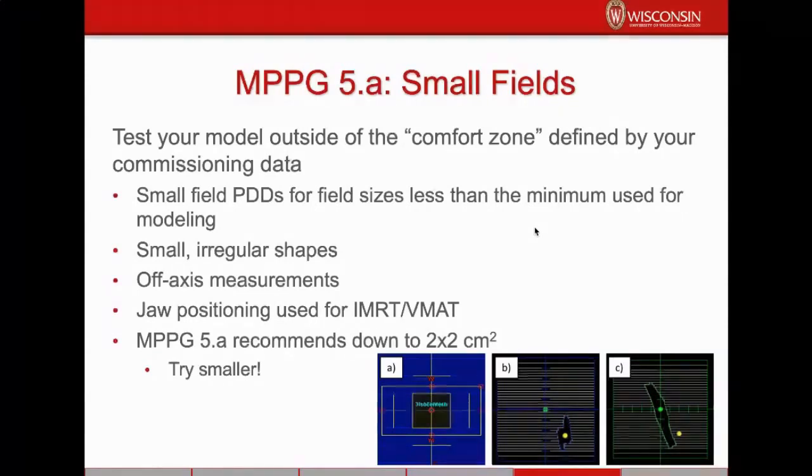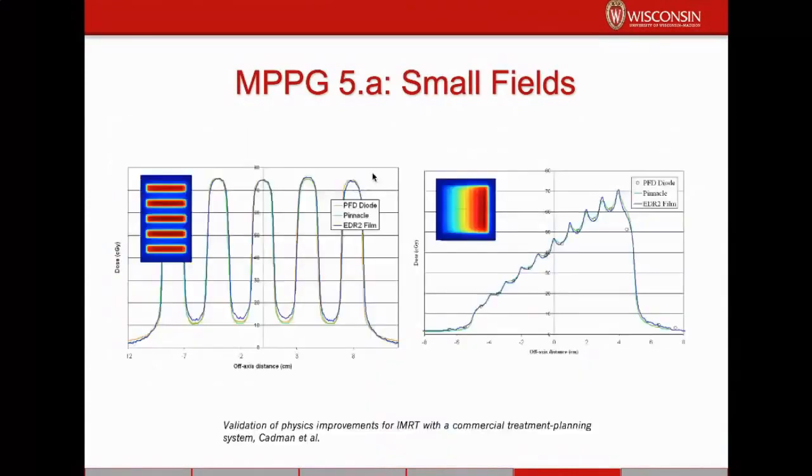The Medical Physics Practice Guideline recommends measuring down to 2x2 fields, but practically speaking, you're probably going to see smaller things clinically, so you should definitely test them.